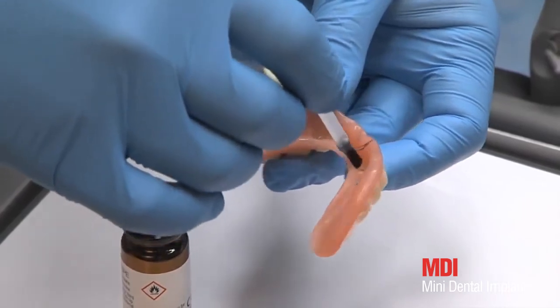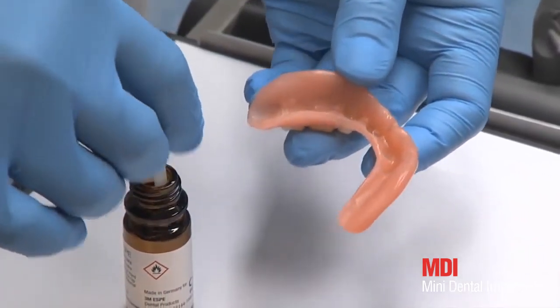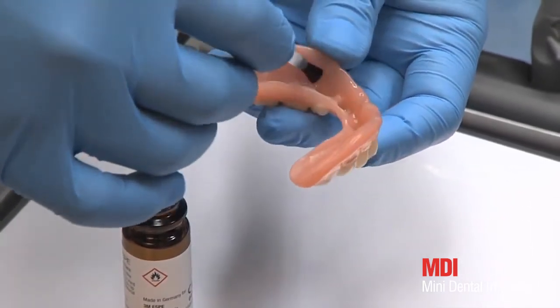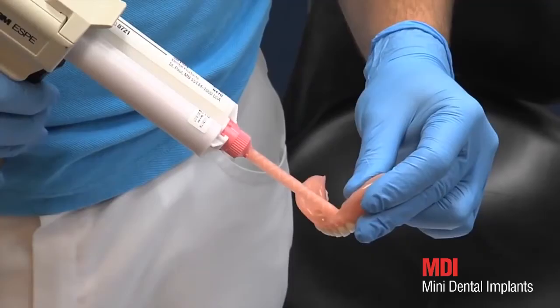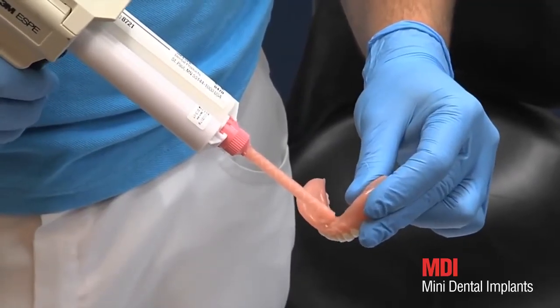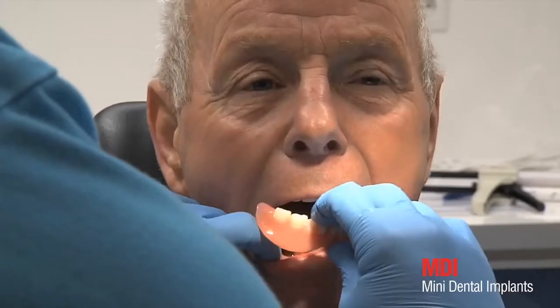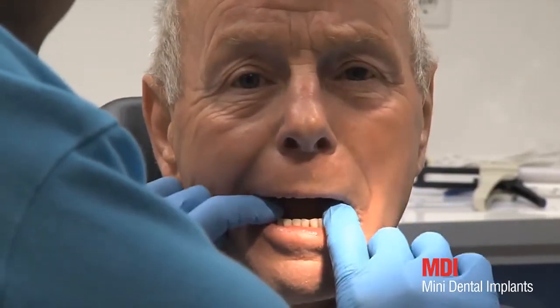Polymerization is prepared in the next step. The recesses of the prosthetic resin are coated with an adhesive, dry for 30 seconds before filling with cold-curing resin. Secure Hard Pickup is an acrylic-based self-curing tissue-colored resin. Its viscous consistency makes it easy to apply. The recesses in the prosthesis should be filled to about two-thirds with the acrylate.